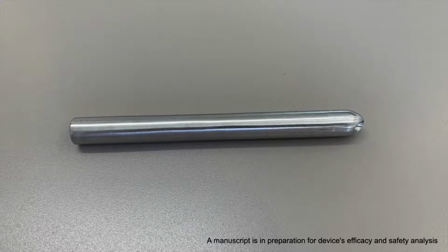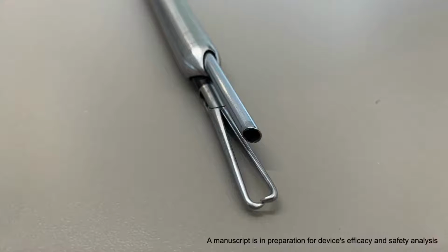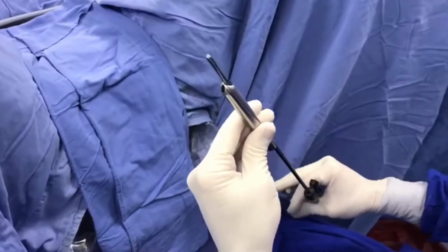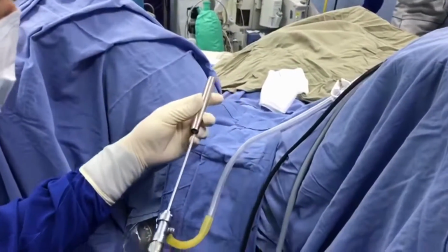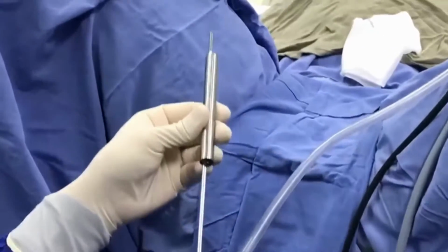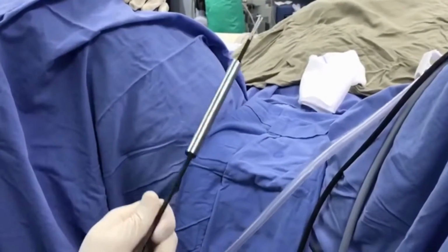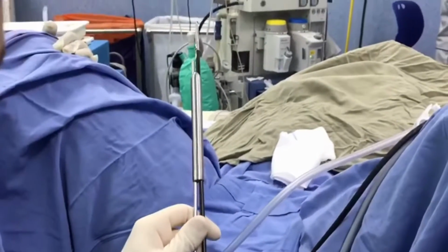To overcome the challenge of excessive retrograde fluid loss through the dilated cervix during the fibroid extraction, we designed a cylindrical double-lumen metallic cervical cannula that adapts itself perfectly into the dilated cervix. This device has 2 lumens through which the Bettocchi hysteroscope with a single flow sheath and the laparoscopic tenaculum forceps can be introduced into the uterine cavity simultaneously, keeping these 2 aligned for adequate visualization.